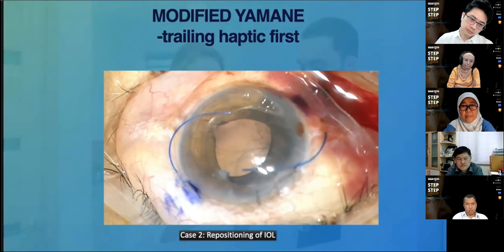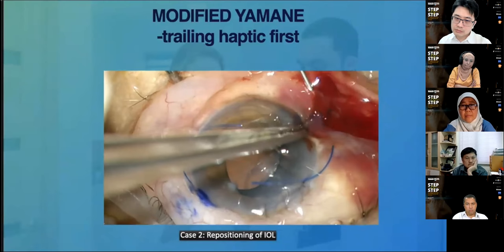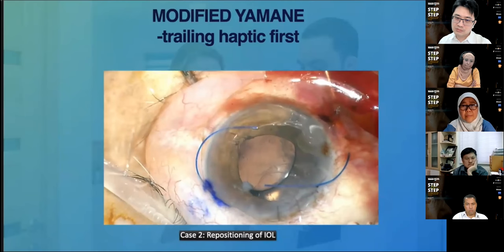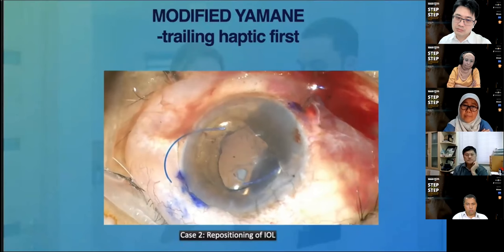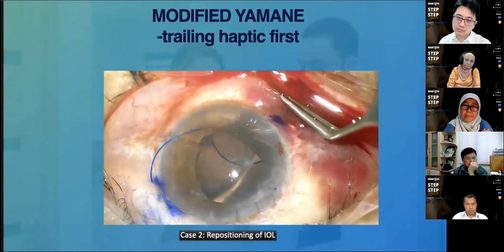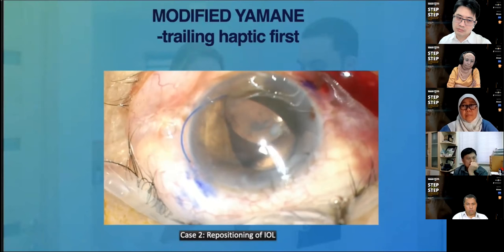So with a forceps, grasp the haptic and thread it into the needle. Cauterize the haptic and proceed with externalizing the leading haptic.